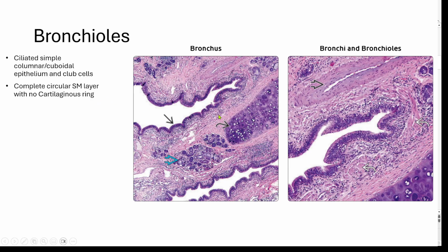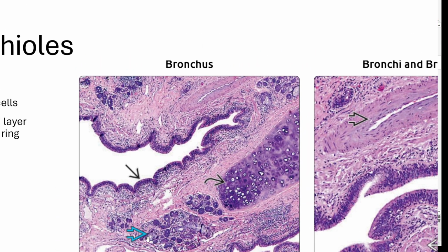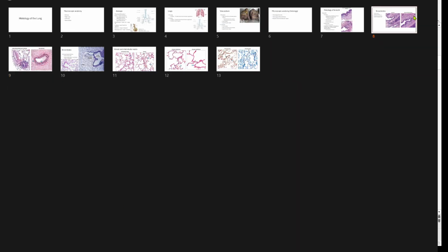If we're talking about the lobar and segmental bronchi, I think that this is pseudostratified. We still can see the cartilaginous ring. This is probably a bronchus, but importantly to remember, in the submucosa we have cartilage, and those seromucous cells. So it's a bit of serous and mucin to lubricate and help remove the gunk.